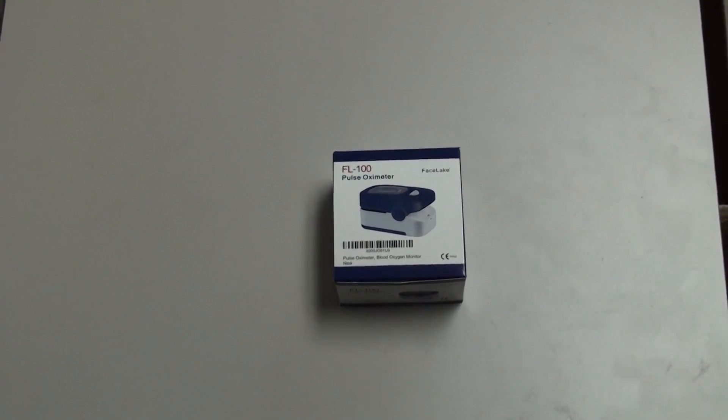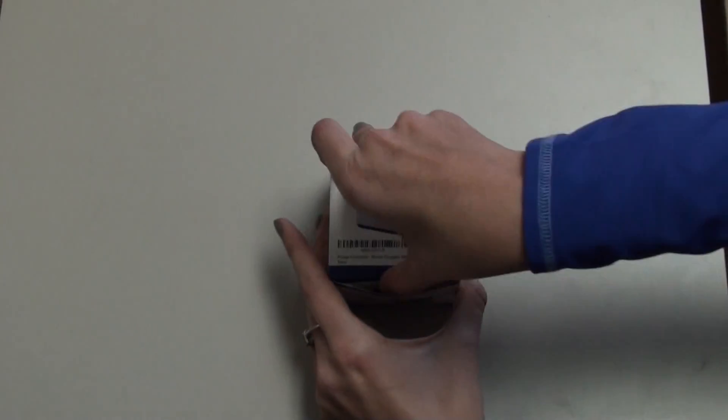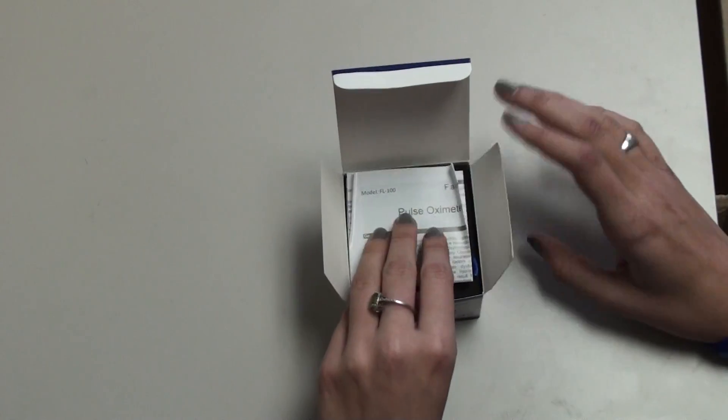This is the FL100 Pulse Oximeter Blood Oxygen Monitor for Continuous Use by Facelig. Today I'm going to give you a demonstration on everything that this product has to offer.